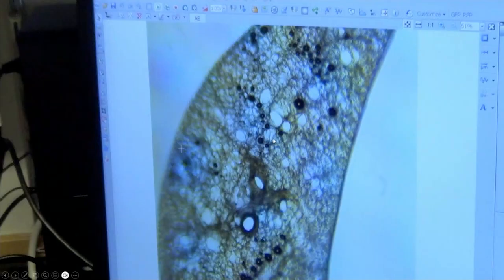These were bubbles that got injected into the mouse lung during the injection process, and they're an unwanted part of the microscopy. During your first attempt to inflate a lung, you might get some bubbles. It takes practice, just handling the catheter and syringes and the whole apparatus.